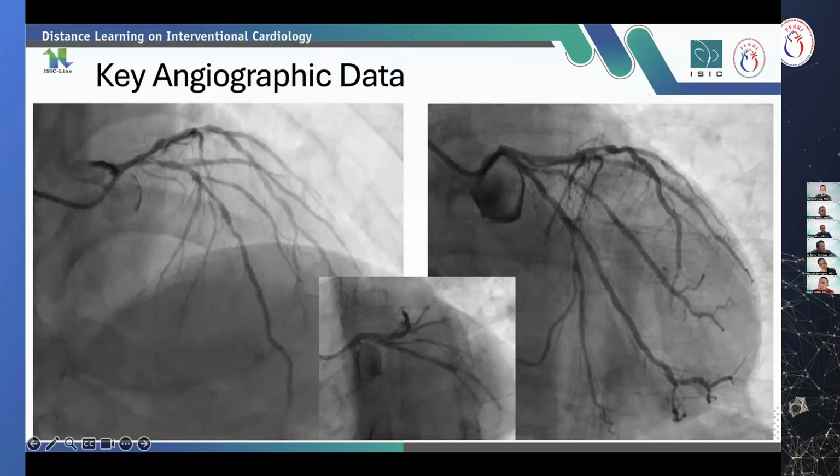It means this actually needs OCT in my preference, because the OCT might appreciate the thickness of the calcium, and for the hypertension, the calcified medial layer could be appreciated by the OCT.